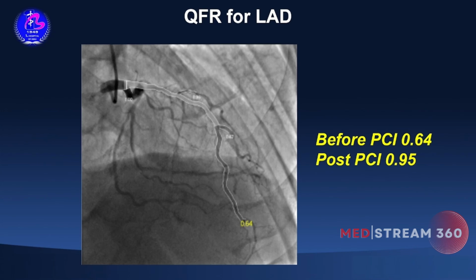The virtual stenting technique simulates the effect of stent implantation in selected segments, using the predicted value of the QFR. By using the QFR-based virtual stenting technique, the QFR of the LAD may increase from 0.64 to 0.95. It could help us make a plan before the operation.